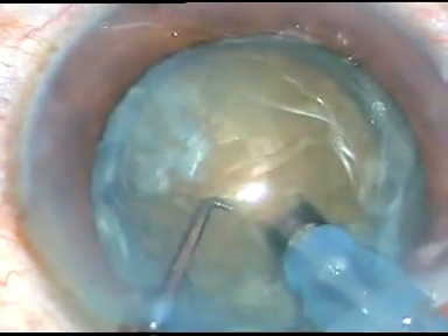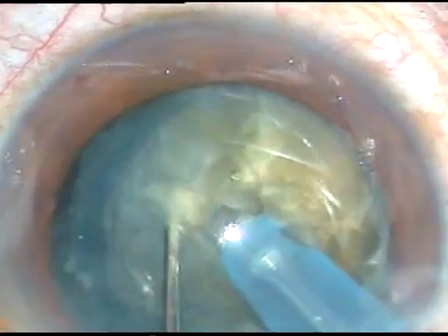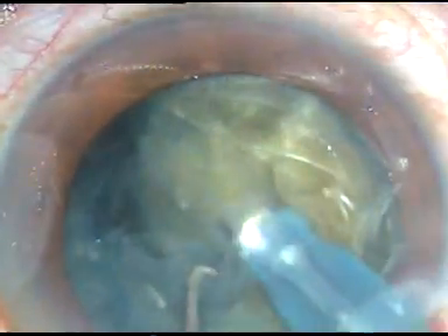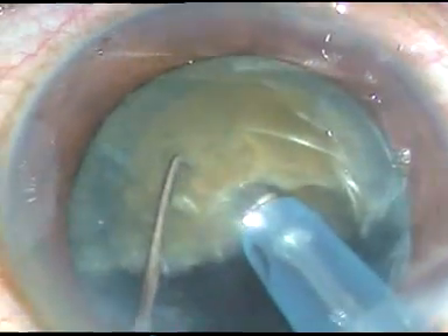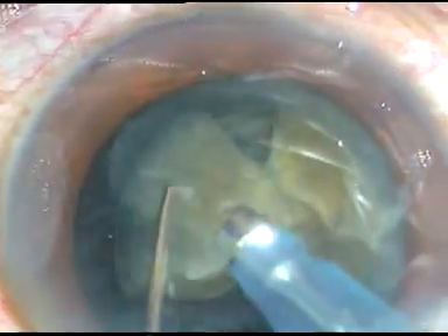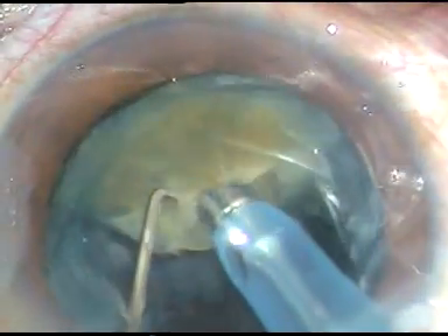Here it is — hold the nucleus at the center and chop it like this. When the chopper comes very close to the phaco tip and the tip is at the center of the nucleus, then vertical chop happens. The nucleus has been chopped into several fragments. Ultrasonic energy is used to emulsify these fragments and they are removed.